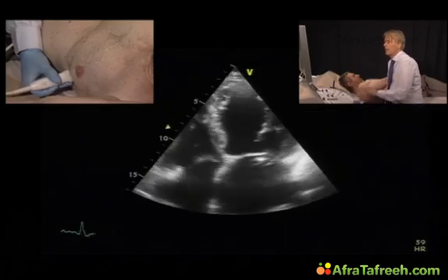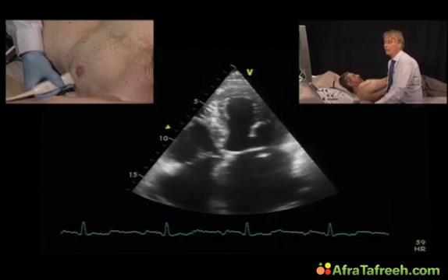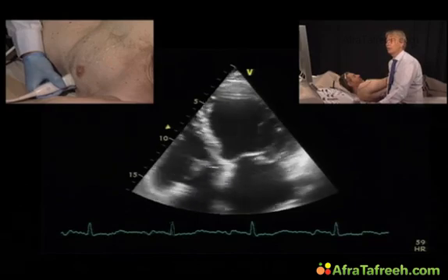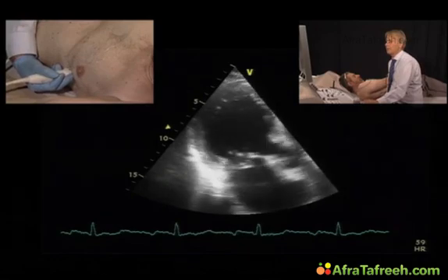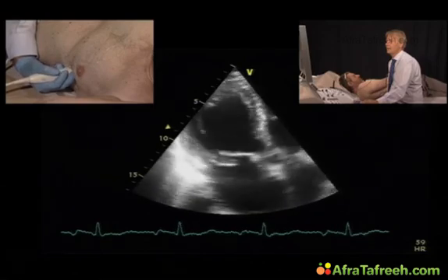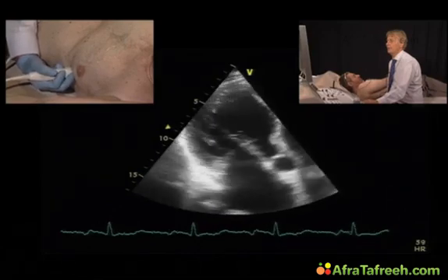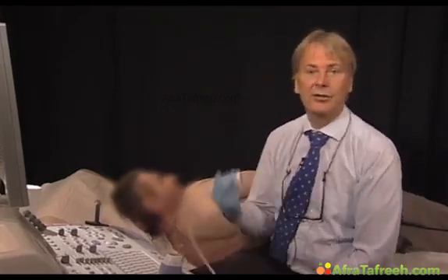So this parallel position of the flail leaflet is a very good sign, in addition to severe forms of flail leaflet where you have a concave contour of the leaflet towards the left atrium. This can also be seen very nicely here in the apical long axis view, where you have a portion of the valve which is in parallel to the posterior leaflet. These patients also very often have very eccentric jets, so this also helps you in the diagnosis.